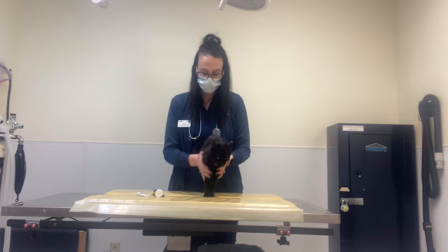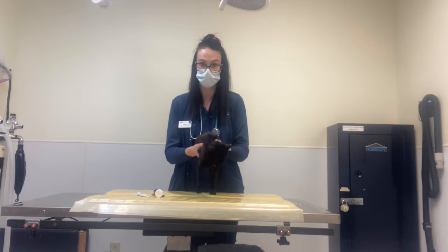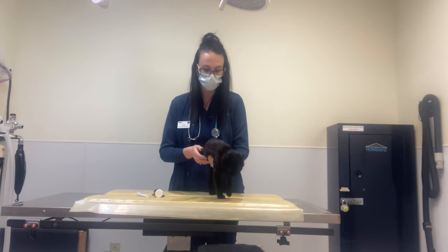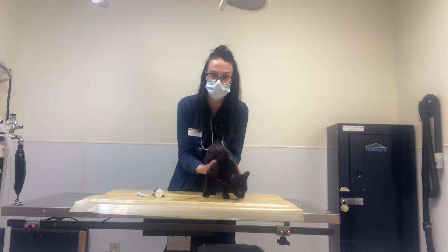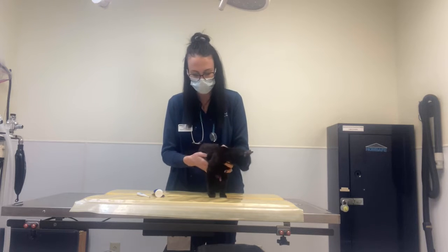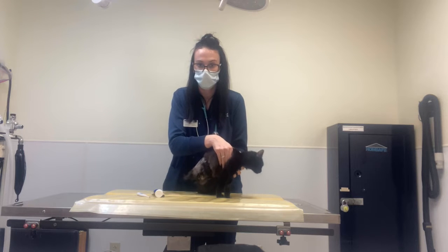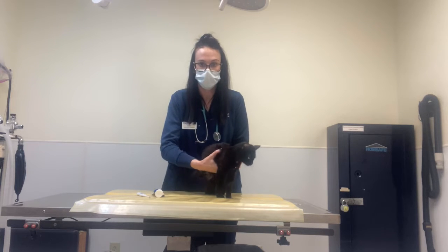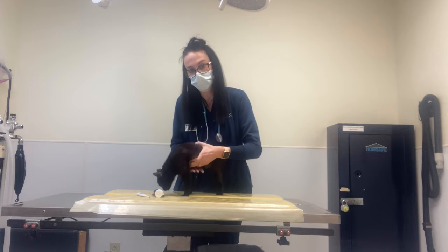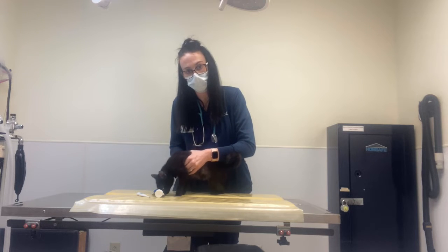For the heart, you want the patient standing, or even cats like to mush into a bread loaf, so even sternal. You want to start on the left side and listen, make sure the heart sounds okay, and then move over to the right side, right under their armpit, and listen to the heart that way.